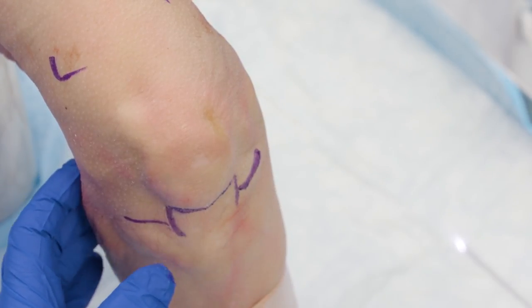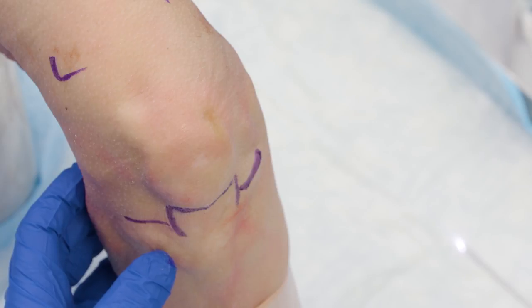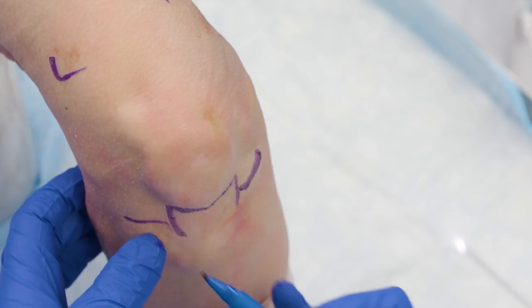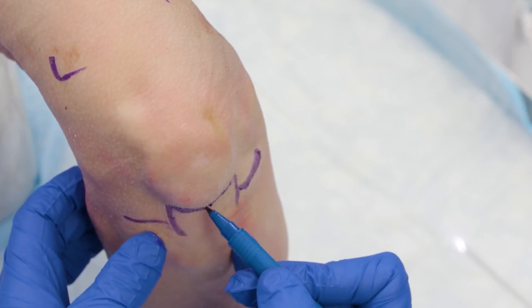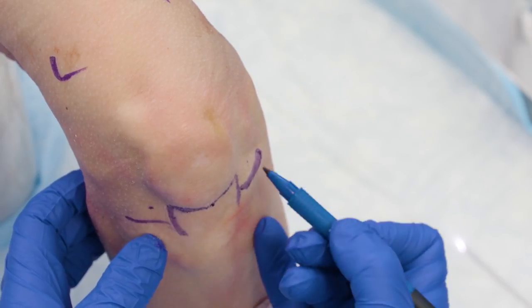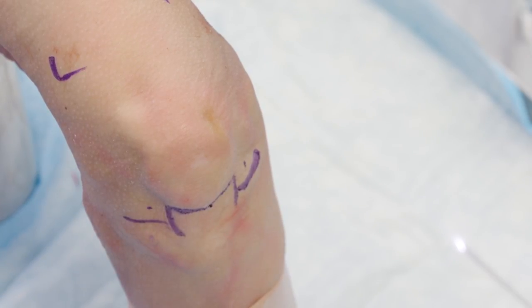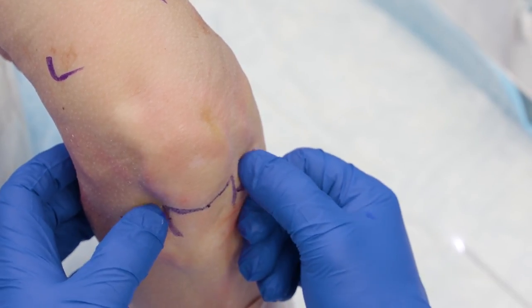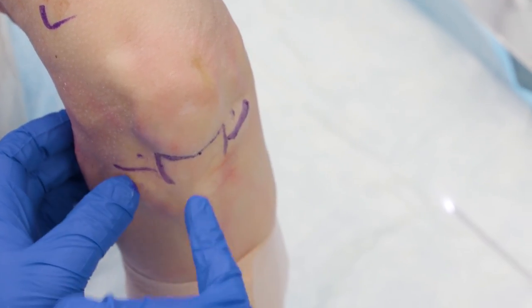Unlike surgical arthroscopy in the OR, this is a zero-degree scope, so I want to be reflective of that when doing my needle arthroscope. I'll come in at the level of the inferior portion of the patella on either the medial or lateral side, about a half centimeter to a centimeter on either side — this helps avoid the fat pad. Once marked, I'll prep sterilely and inject a skin wheal with about one cc of one percent lidocaine on either side to anesthetize the skin without inflating the fat pad.